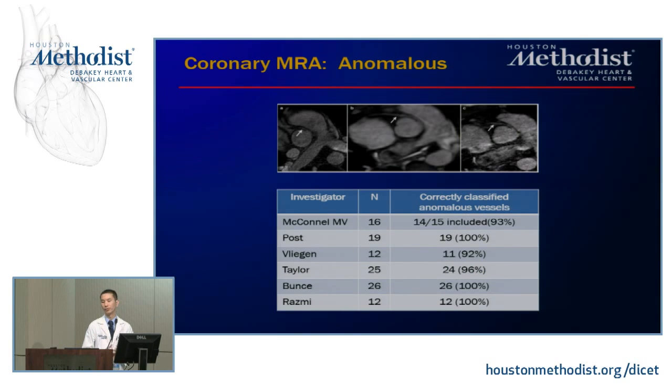And of course, another reason we often get patients referred to us for cardiac MRI, for coronary MRA, I should say, is looking for congenital anomalies. We still can do it. We do it a lot in our congenital population, and of course, sometimes patients are sent for this. But again, if I had a choice, being able to look at the more distal vessels, I would prefer cardiac CT over CMR for this.